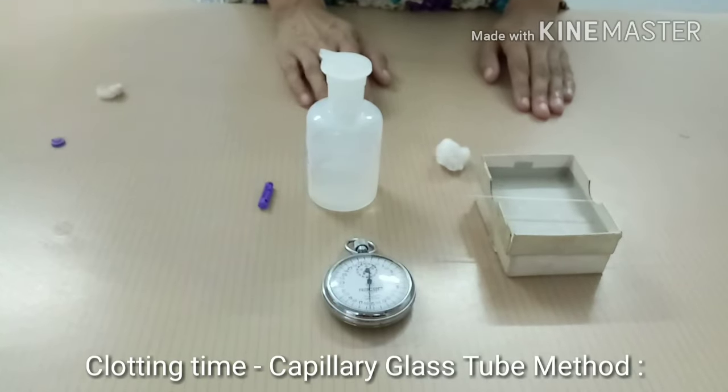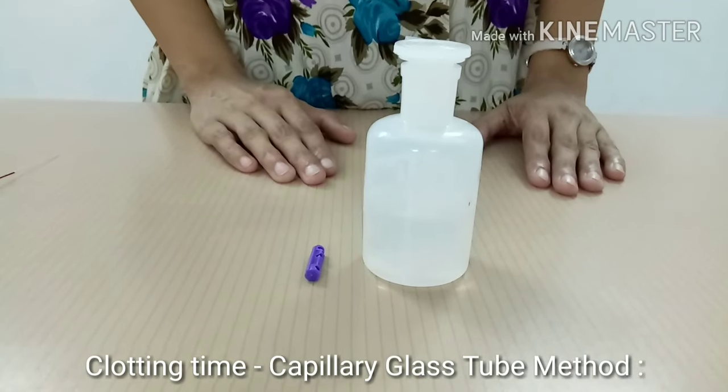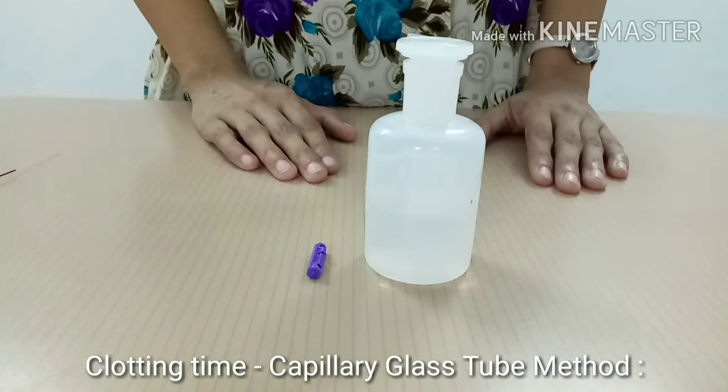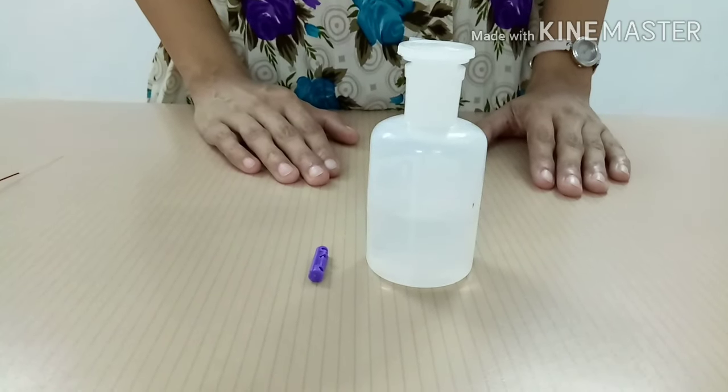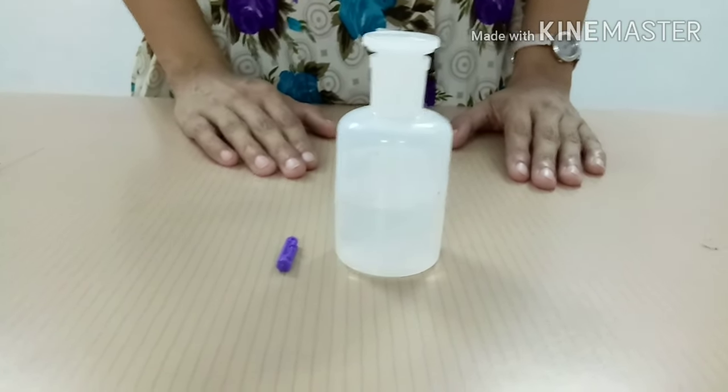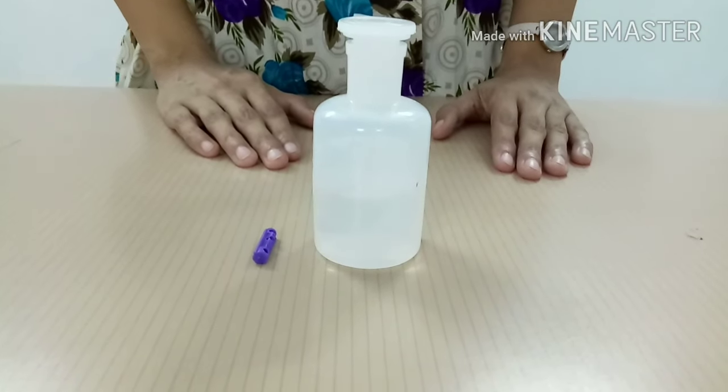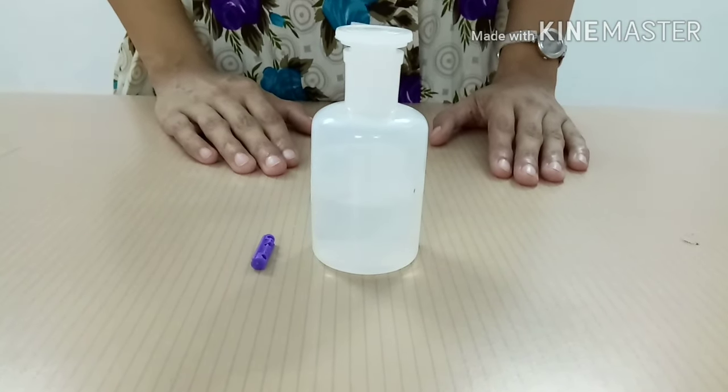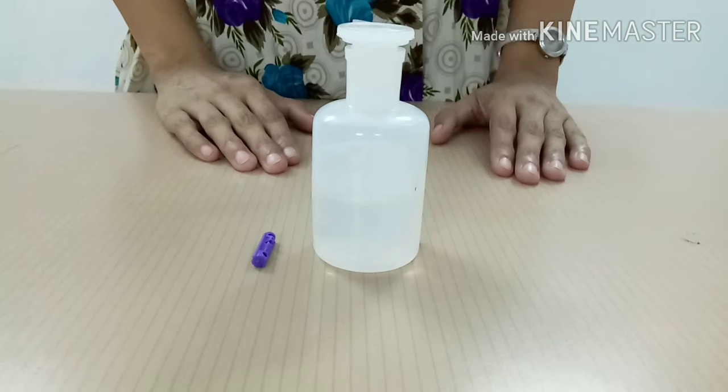Let us perform clotting time by capillary glass tube method. Principle: A skin puncture is made and blood is taken into capillary glass tube. The length of time that it takes for the blood to clot is known as clotting time.